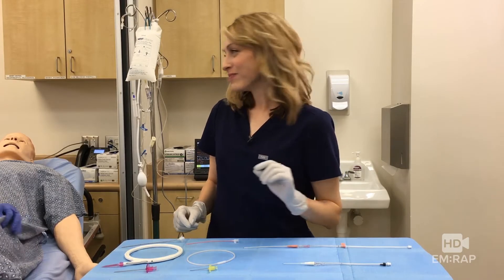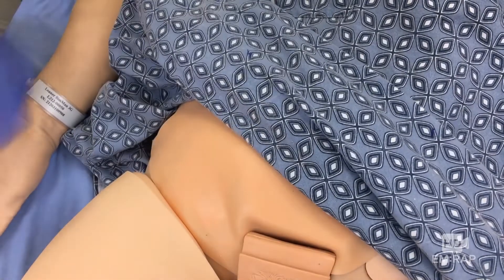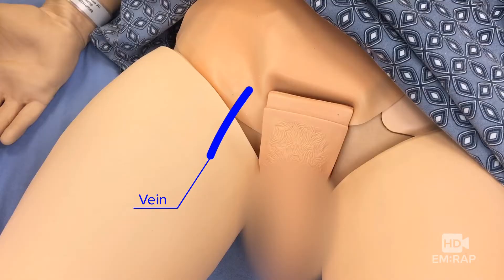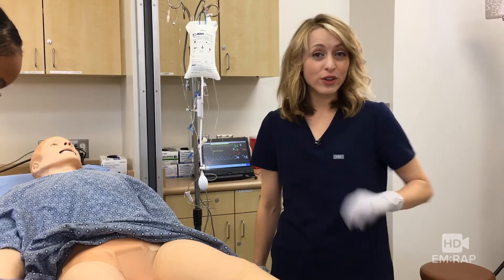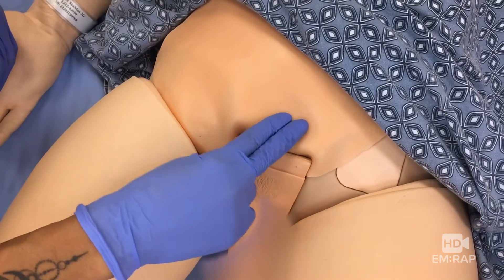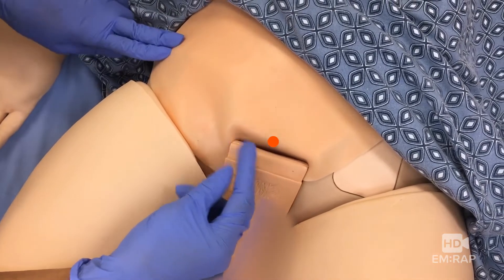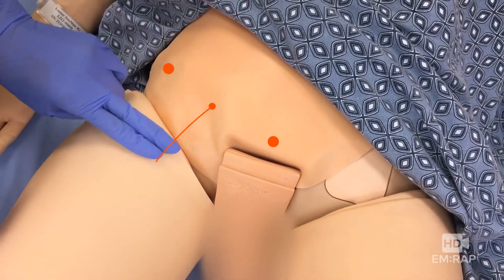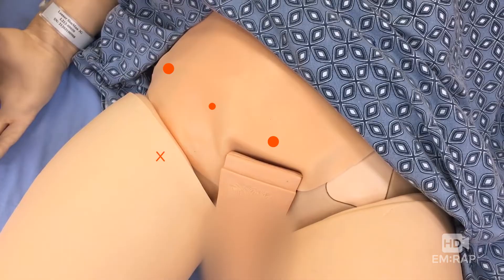Let's review the landmarks. You can remember the anatomy by the mnemonic VAN — vein, artery, nerve — venous, close to penis. If you don't have ultrasound and you're doing this blind, palpate the pubic symphysis and the anterior superior iliac spine. The femoral artery is at the midpoint between these, and go just inferior to the inguinal ligament.